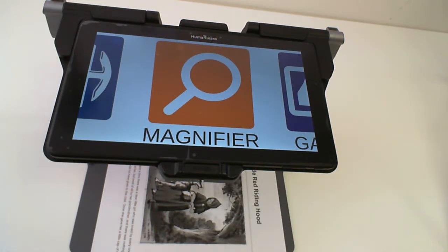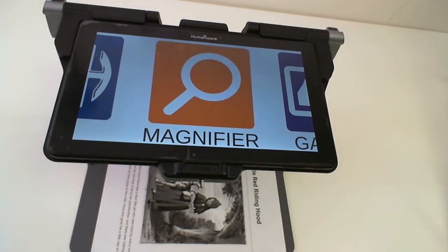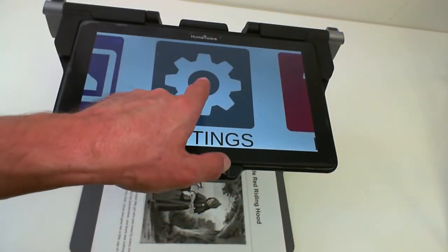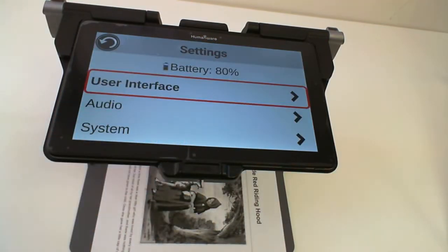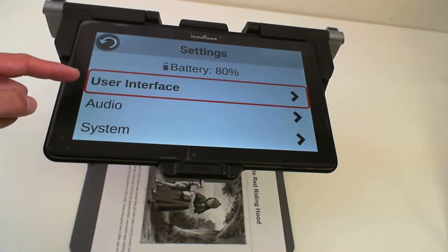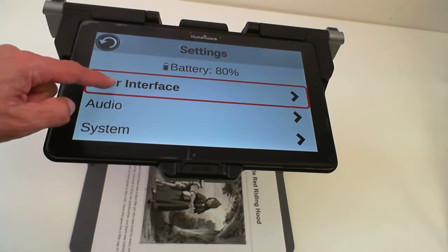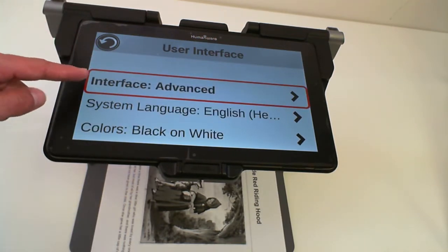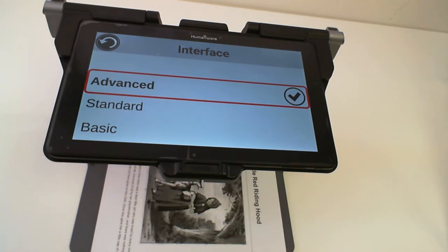These interfaces are available on Prodigy 4.0.0. In order to select these new simplified interfaces, we have to go into the Settings application. In Prodigy, in Settings, we select User Interface, and then in User Interface, we select Interface. We have three options: Advanced, Standard, and Basic.